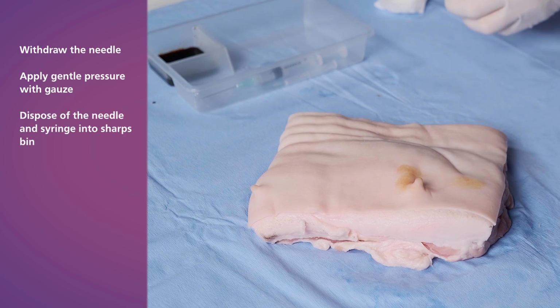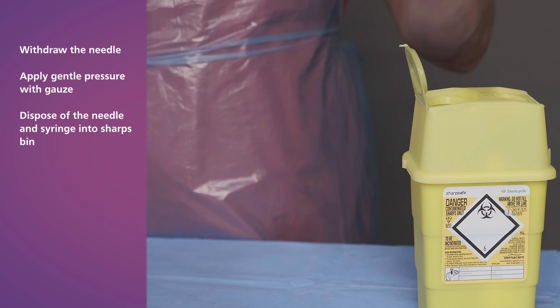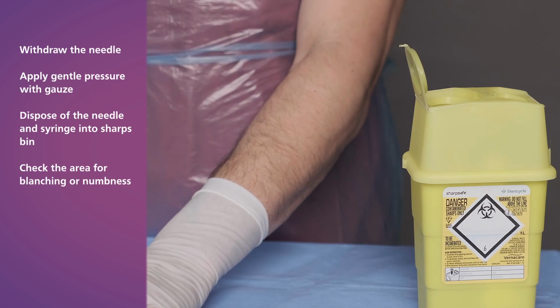Dispose of the needle and syringe safely into the sharps bin. Check the area for blanching or numbness before starting your procedure.